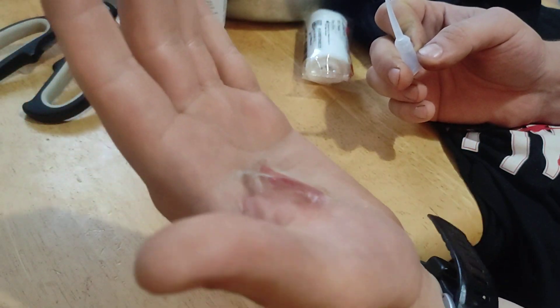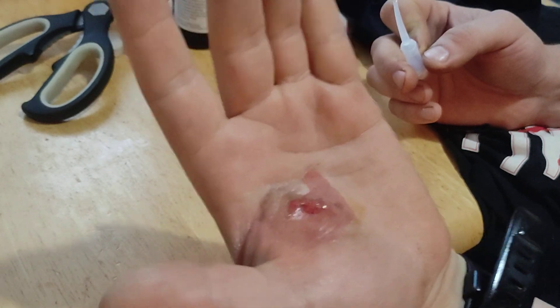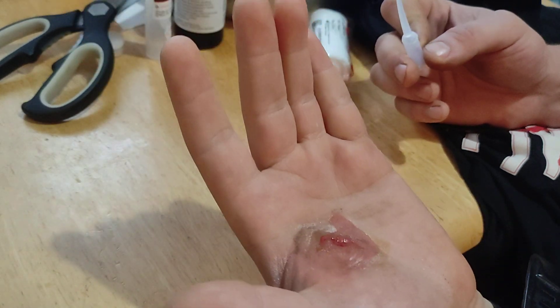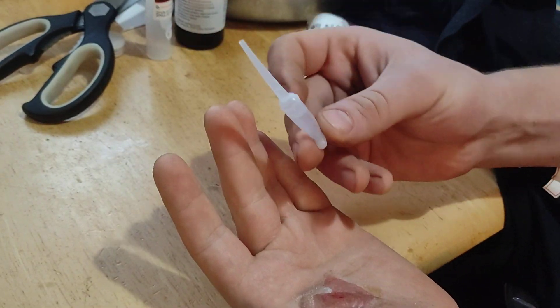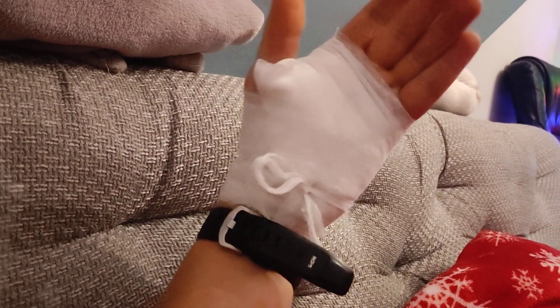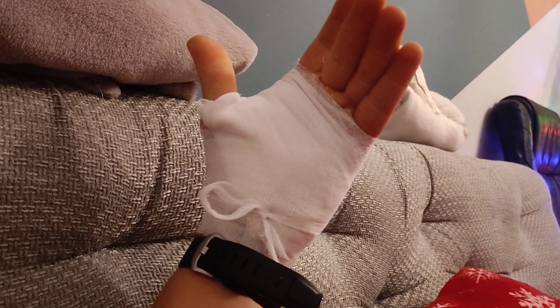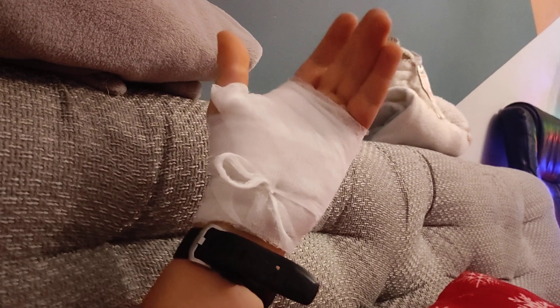I'll glue myself — we'll see what's going to happen. I'm not going to post the video yet; I'll actually hold for 10 days and we'll see how it healed. I need to bandage it. I'll show you the bandage. But that's how to glue yourself. After I glued myself, I bandaged it — only to not be able to move my hand so much, and it's keeping some pressure on the wound. But you shouldn't actually bandage yourself with the glue — so keep that in mind.